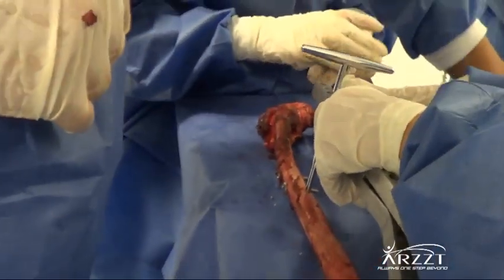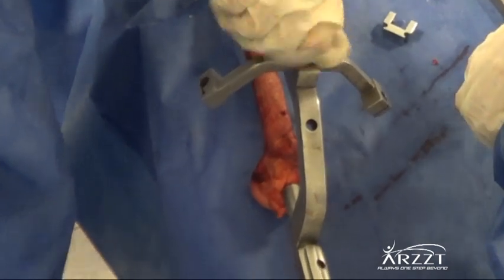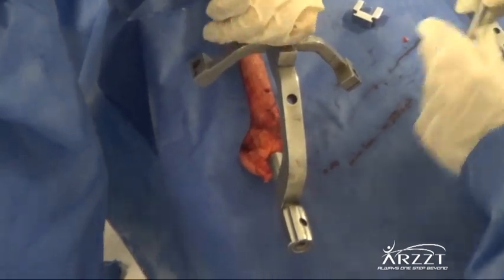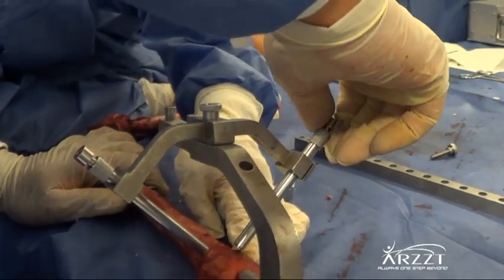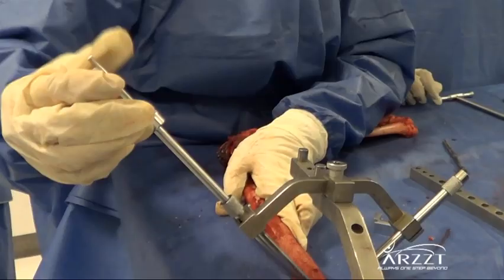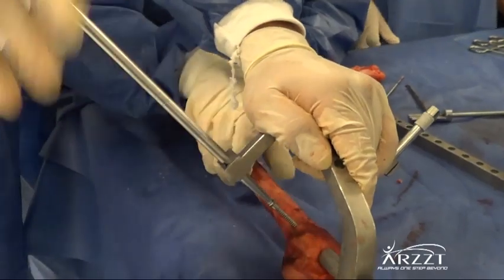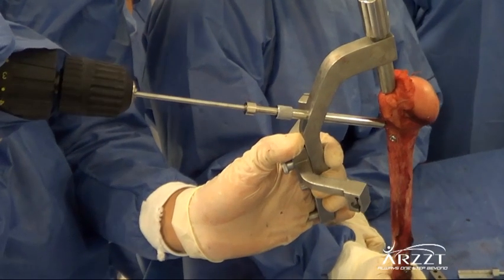The next step is the location and drilling of the proximal holes, with 3 different locations at 3 levels. The orthopedic surgeon will choose which are required; up to 3 holes and 3 screws can be used depending on fracture characteristics. The same steps performed for location, drilling, and blocking used for the distal holes are repeated, and the proper length screws are inserted. The nail clamp is removed.